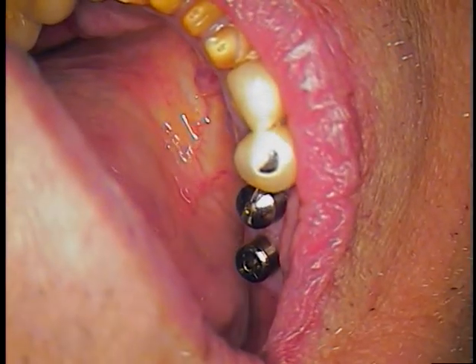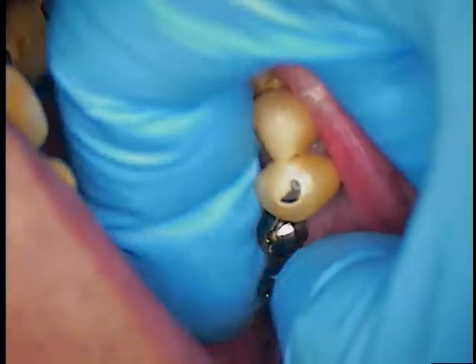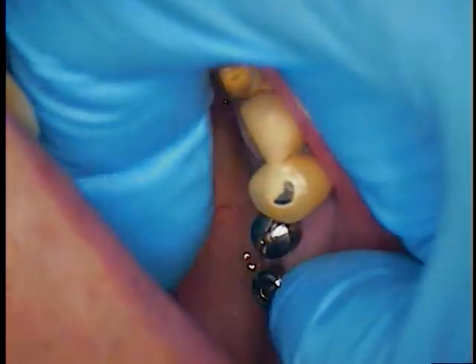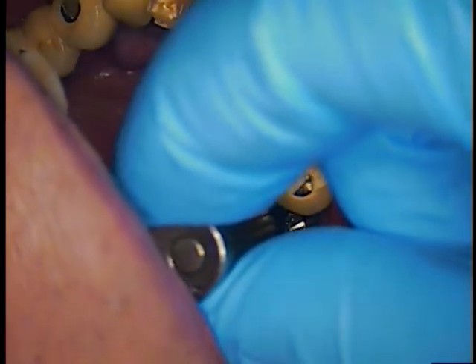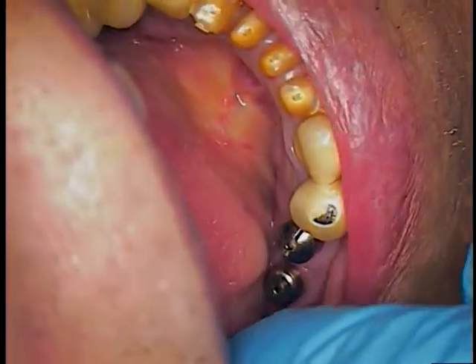There's our next one in there. Let's give that a little hand tightening. Let's see the threads on this one — let's see how this one works. Open up again a little bit. Good, that one hand tightens. And that one too. So now these two are going to keep those two implants happy. And now we've got the last one in the back.